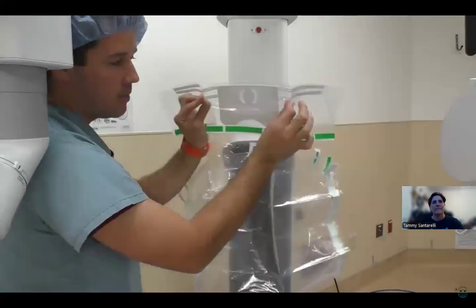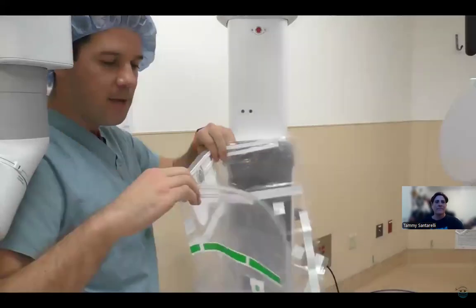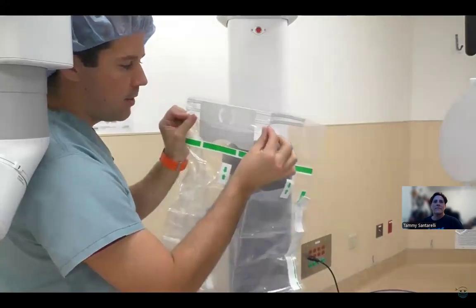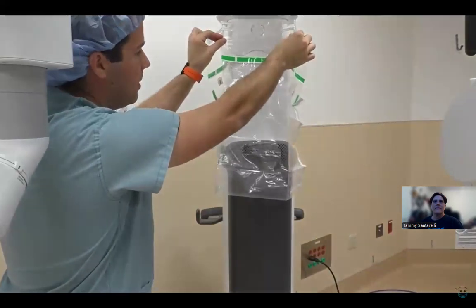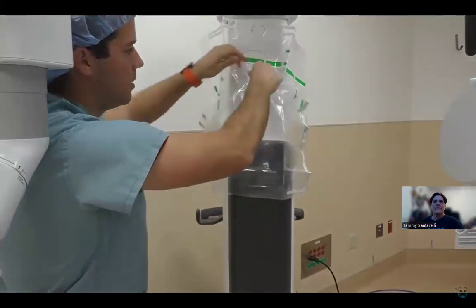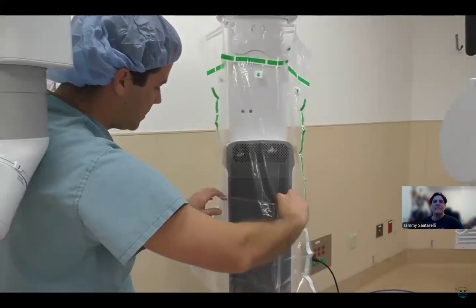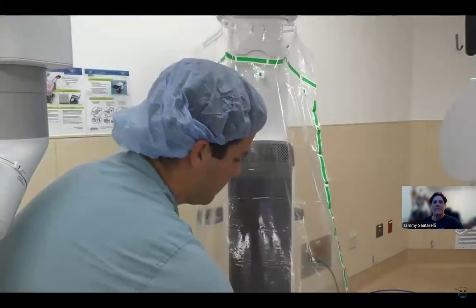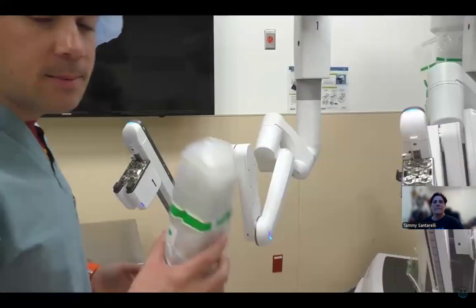Hands are touching the outsides of the drapes. This already has a formation of a square to be able to go right onto that tower. So I just like to hold right underneath those, put it right there on the magnet. I'm holding the outside of the drape, and you're just going to tear the tapes, pull the drape down, always handling the outside of the drape itself. That's the tower drape. Next is going to be our arm drape.